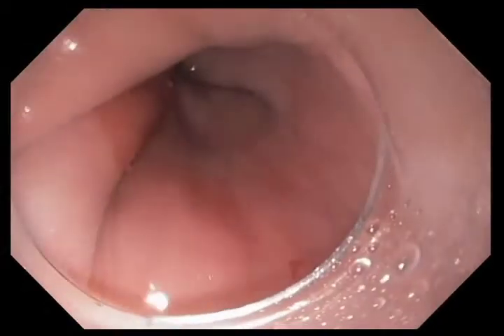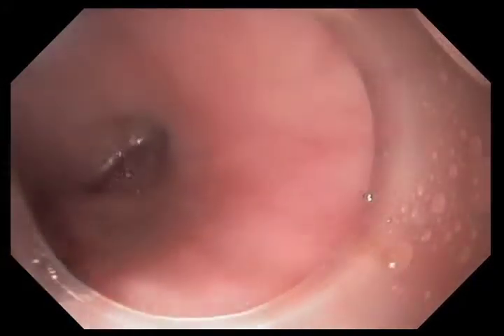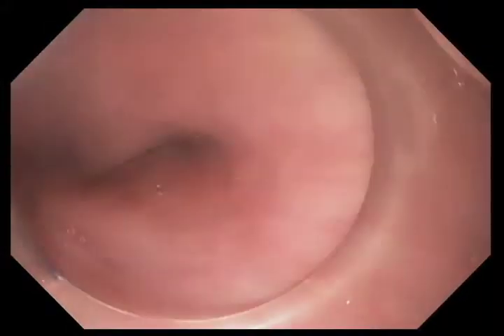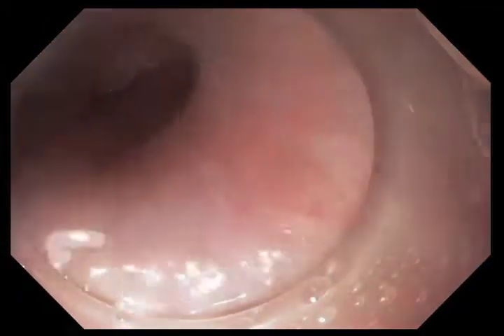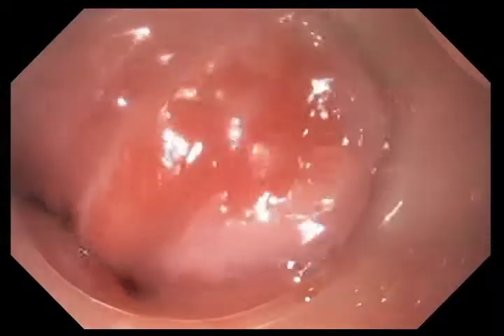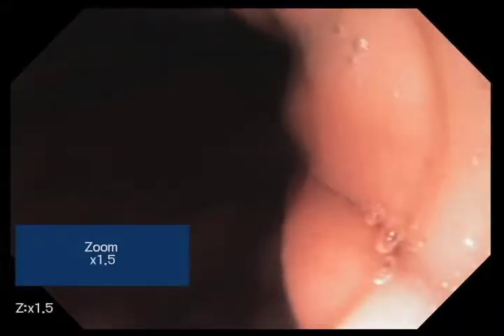We're beginning the examination with a standard endoscope fitted with a cap. You can see with white light at the 9 o'clock position an island of residual Barrett's. Normal squamous epithelium is white, and the Barrett's is a pinkish type of epithelium. We're now moving toward the GE junction, passing an area of scar tissue. This patient has had a prior EMR for an area of high-grade dysplasia, and now you can see with white light these tongues of Barrett's epithelium.